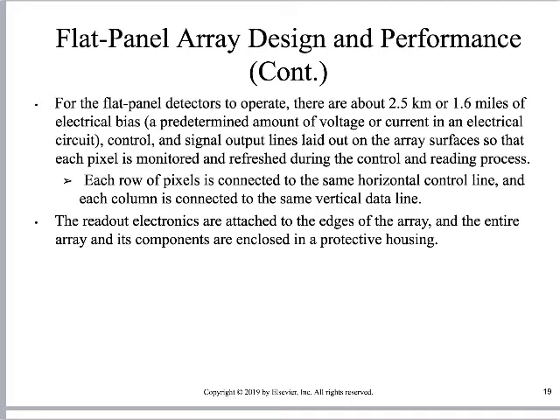All right, for the way that these things work, we just need to know that there are a lot of little tiny wires inside these things. And those little tiny wires are going to be part of our problem. Now, oftentimes they're just integrated circuits, so it may be wrong to think about them as wires, but they're highly complicated integrated circuits, right? But what you need to know is the way it's read out, they're going to have a row of DELs connected in the same horizontal control line, and then a vertical data line, right? This is what she's getting at here on this illustration, right?